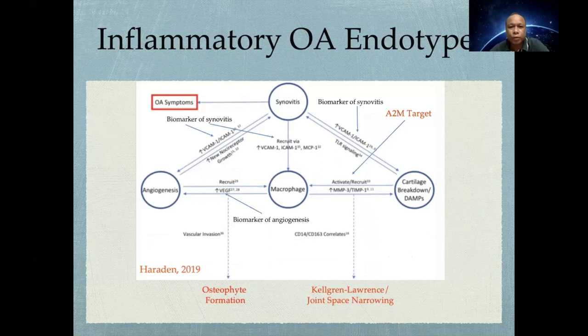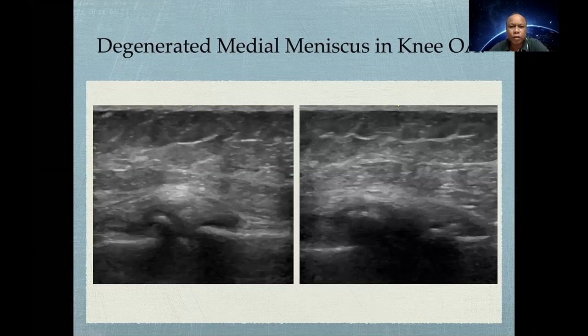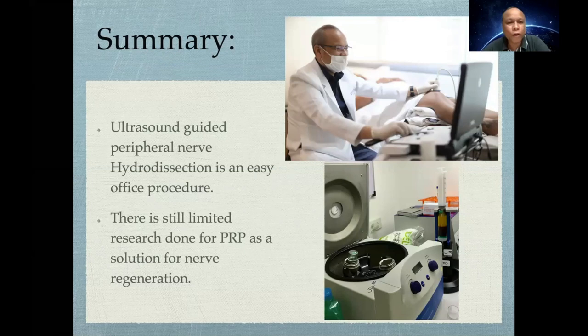So this one here is an osteoarthritic knee with synovitis, and of course synovial fluid with degenerated meniscus and osteophyte formation. This is also a degenerated meniscus in knee osteoarthritis. And of course, we treated it also with A2M. So in summary, ultrasound-guided peripheral nerve hydrodissection is an easy office procedure, although there's still a lot of research to be done to look at nerve regeneration.